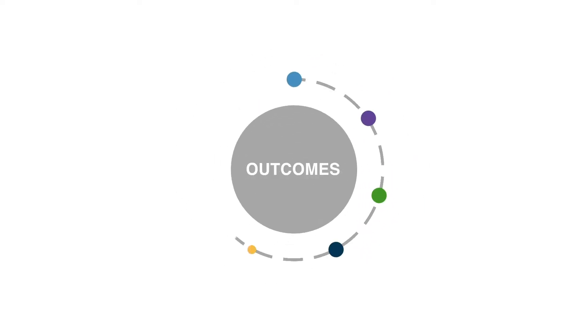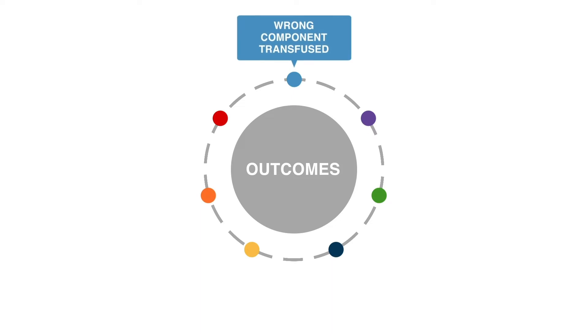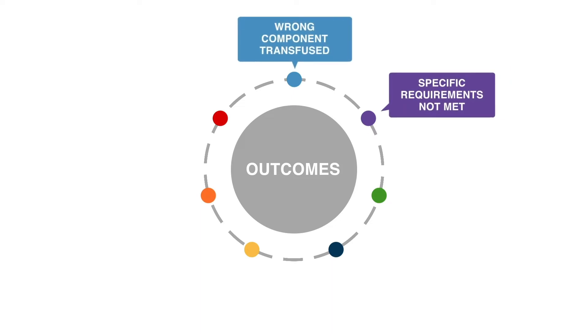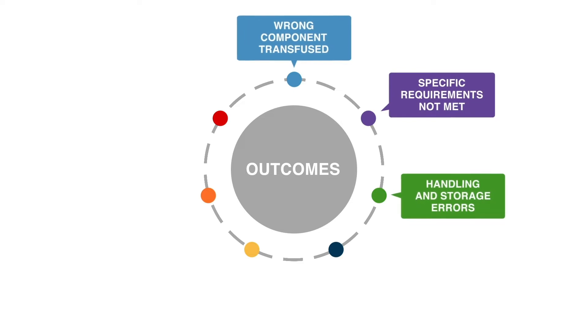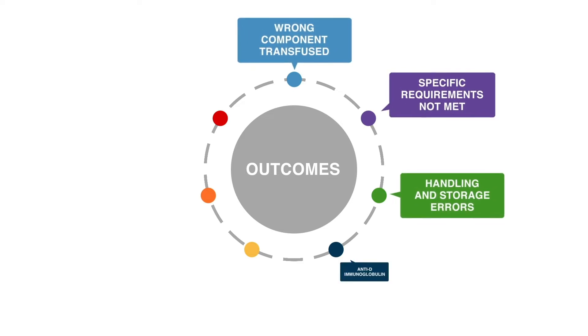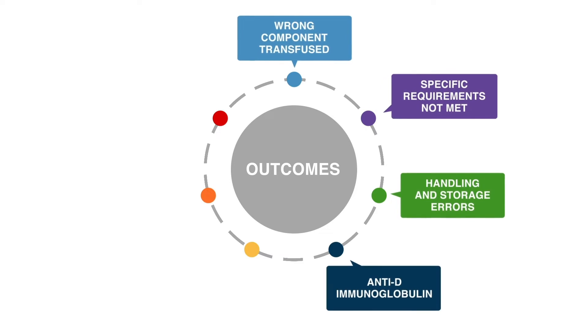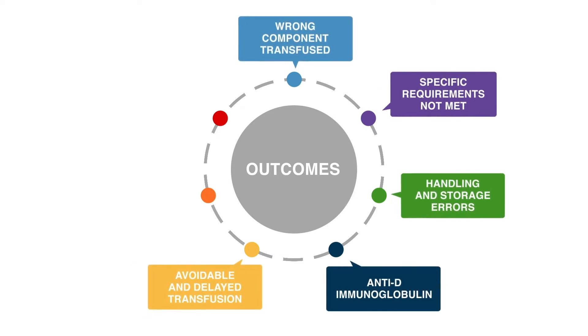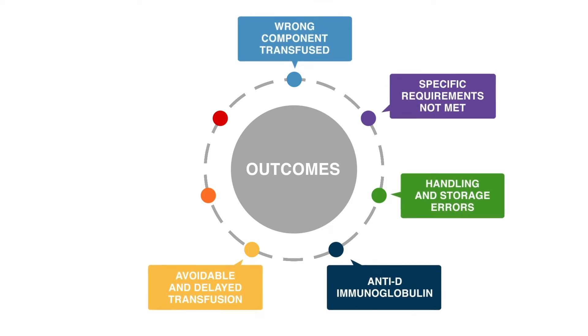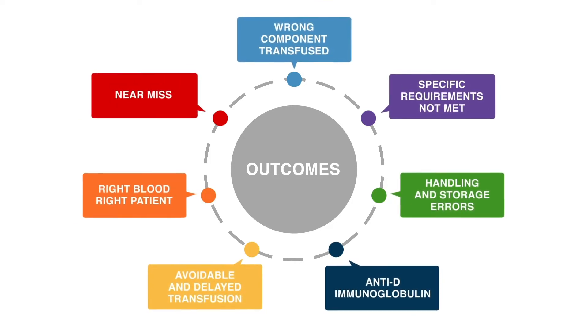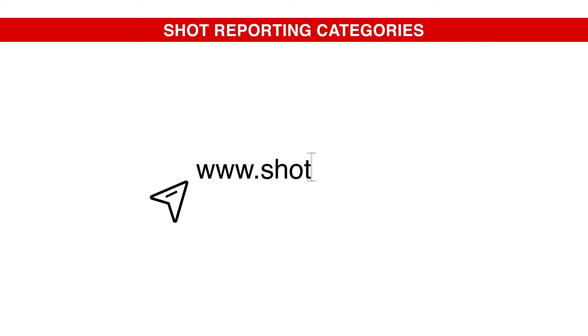On average, one-third of the total incidents reported to SHOT originate in the laboratory. Laboratory errors have resulted in the wrong component being transfused, components where the specific requirement was not met, handling and storage errors, errors associated with late administration and omission of anti-D immunoglobulin, avoidable and delayed transfusions, and near miss incidents. For more information on SHOT reporting categories, please visit the SHOT website at shotuk.org.